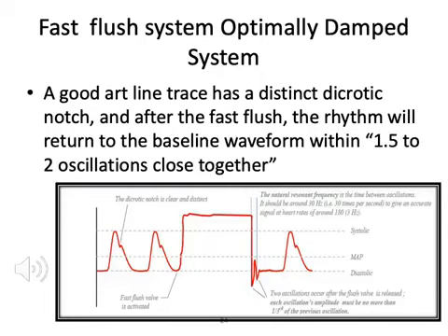Again, this is the optimized system. As you see, after square wave في عنا oscillation 1.5 to 2 oscillations closer together، وبعدين الويف غالبا this is an arterial wave، فلازم رح نحكي عن الارتيريال ويف والكاركترستكس للارتيريال ويف كيف نعرف إنها if it's normal or not.